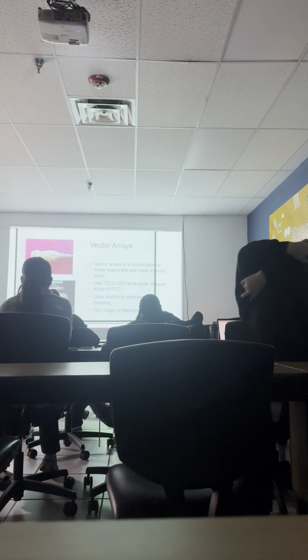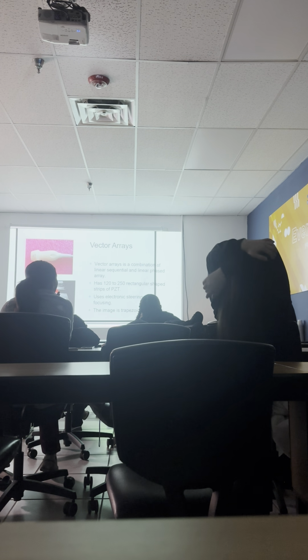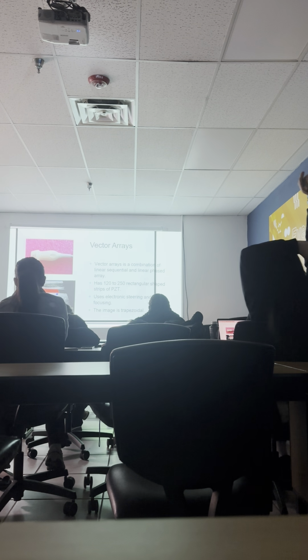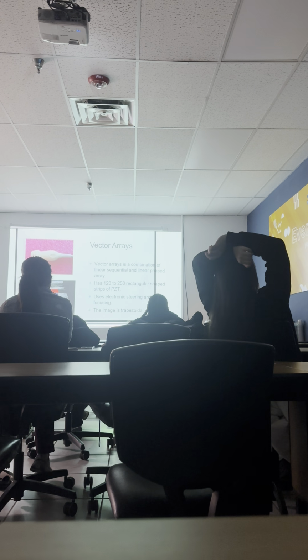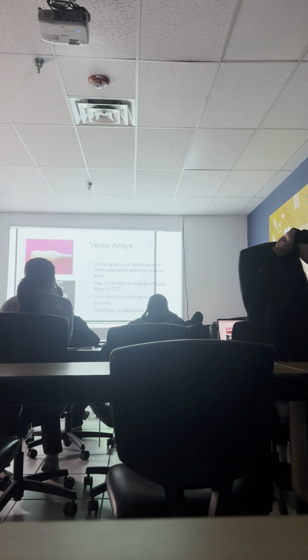So we can actually scan through the baby's head to look for brain bleeds. So we're doing premature babies at that point, babies that are like the size of a water bottle. They're tiny. Those are the most stressful exams.